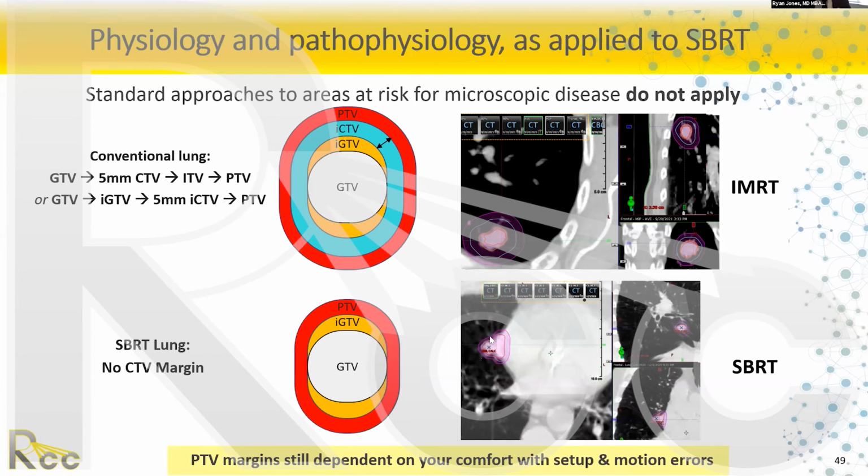So if you back, they did often 5 millimeters all around or 1 cm, and with 1 cm sup inf. You're getting that 5 millimeters from your planning target volume, prescribed dose. And that is the point where you're seeking your prescription dose. Well, as it falls away from the physical limitations of dose, you're getting some medium-high doses for an extra few millimeters that he believed was covering that microscopic disease, and it worked out. We see wonderful local control rates.